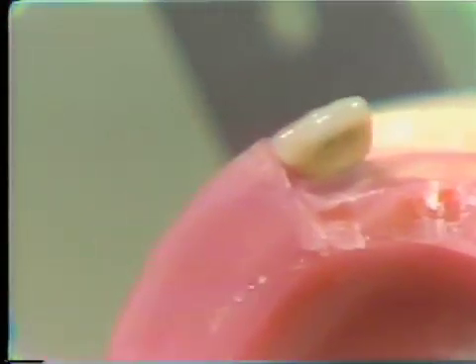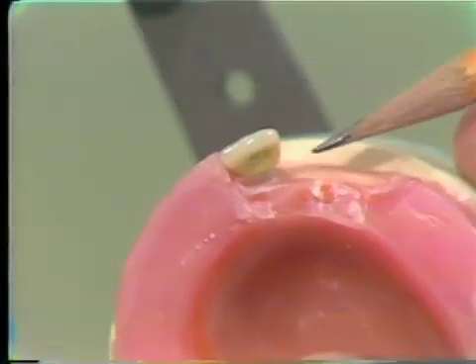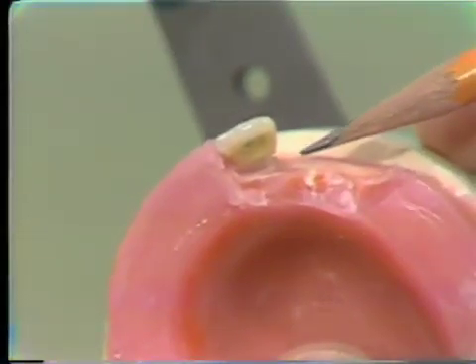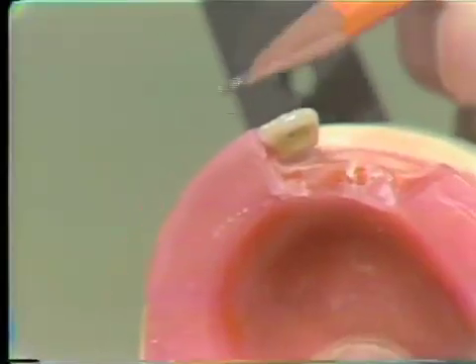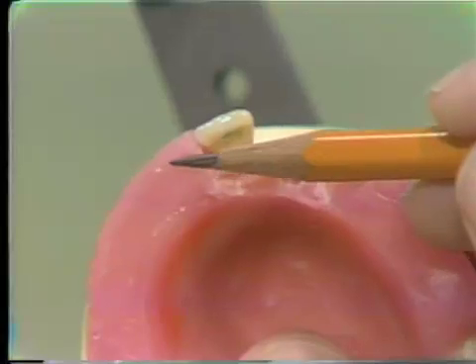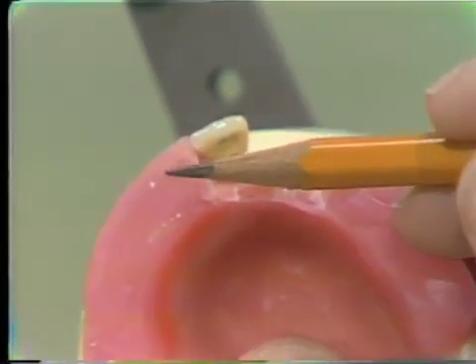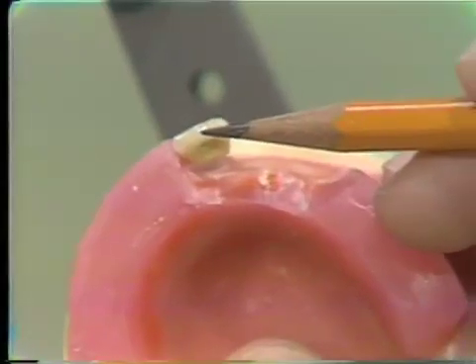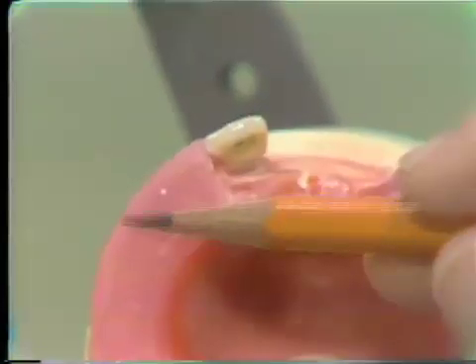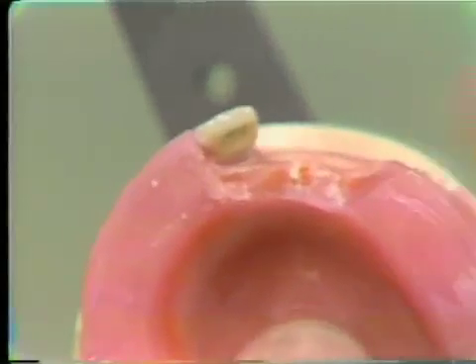Now some of you will have the tooth too far to the labial if you're on your base plate. We've mentioned that. Now if your pins are on the stone cast or very close to it through the base plate, and you find that your wax rim is too far to the lingual, say, this means in this particular exercise that you have constructed your wax occlusal rim too far to the lingual. Because this is a self-limiting item in this exercise. In an actual case, you would definitely follow the rim even if you had to grind on the tooth. There should be no necessity in this course for grinding on these teeth at all.